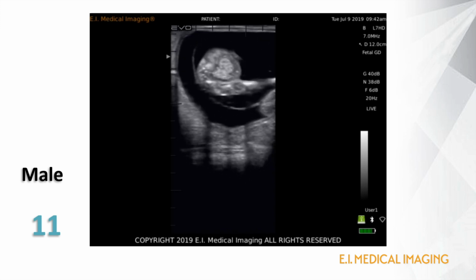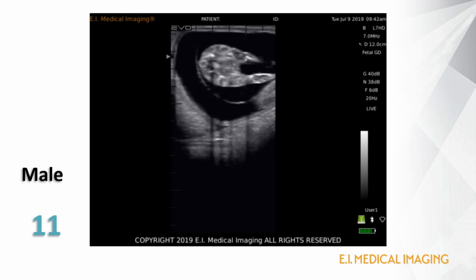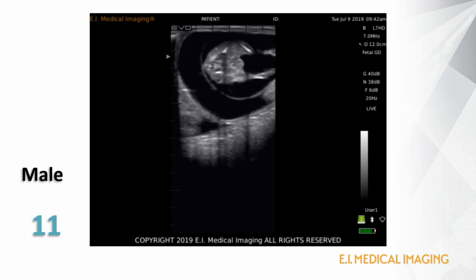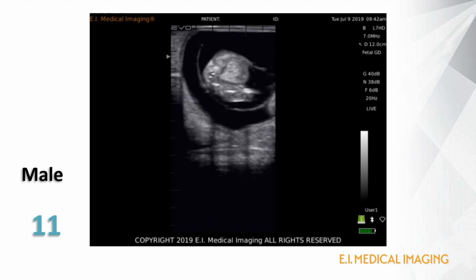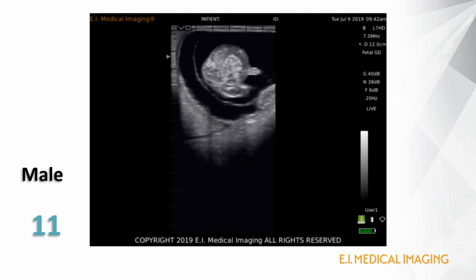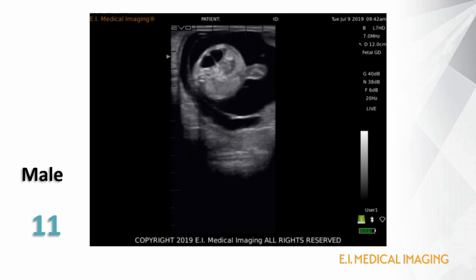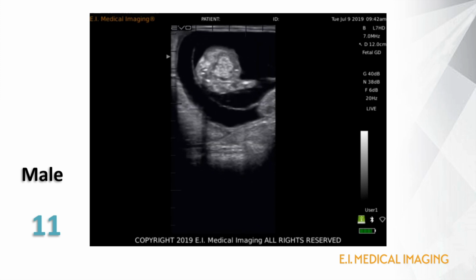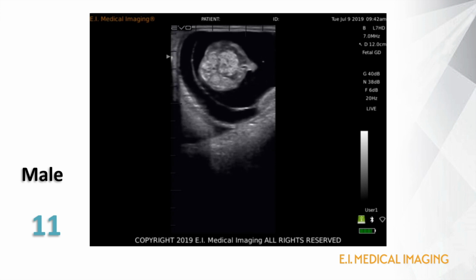It's a 74-day pregnancy with outstanding detail. In this example, there is a male GT adjacent to the umbilicus. Because it's in a transverse plane, we have to actively fan back and forth over this area to see one and then the other structure next to each other. The GT is finite in length and more hyperechoic, and the umbilicus has its classic appearance with the vessels clearly seen.